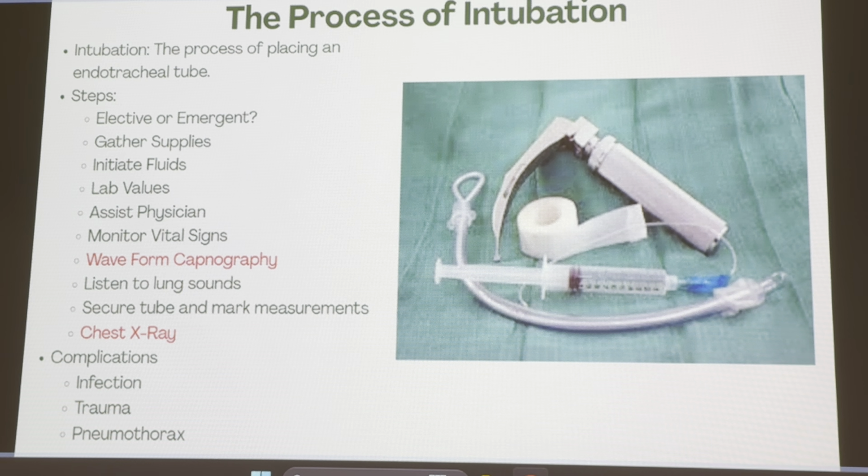Probably need the ventilator, right? I mean, unless you want to sit there and ambu bag them all night. That's not my idea of fun. So probably grab a ventilator. Who runs the ventilator? Respiratory. Should respiratory therapy know that we're fixing to intubate somebody? Definitely. Otherwise, you're just going to be hitting buttons on the ventilator and hoping for the best, right? Respiratory therapy went to school for 2+ years or more, just like y'all did, just to take care of the ventilator and airway. That's their only job, is to take care of the airway. Let's get them involved, all right?